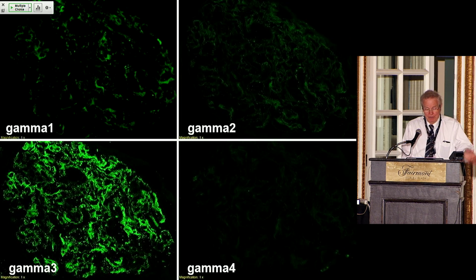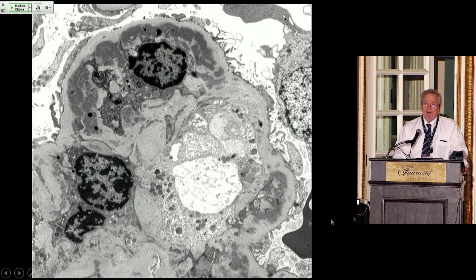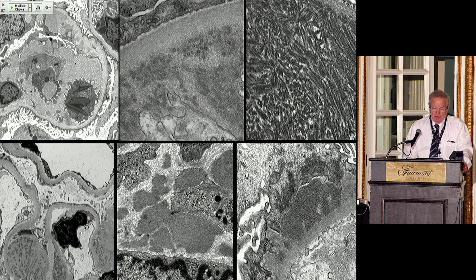Yes, it's a mouthful, but it tells you what the patient has and not something that you have to imagine when you get the biopsy results as idiopathic anything. So by electron microscopy, these look like immune complexes, and therefore you cannot tell them apart from immune complexes. Occasionally, the deposits look different, but not every case of paraprotein deposition disease will have unique features by electron microscopy, and therefore, if you don't do the subclasses by light chain and by heavy chain, you will never know.